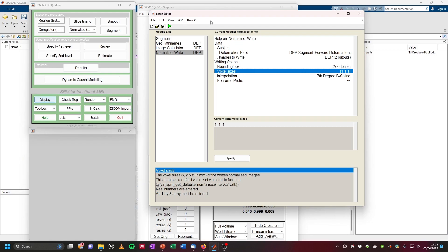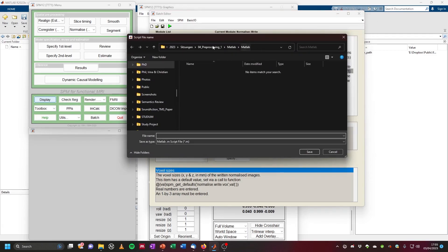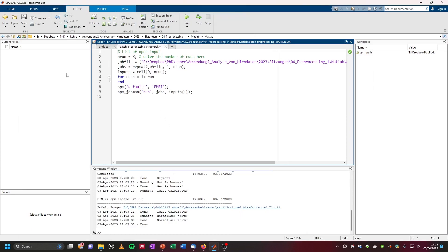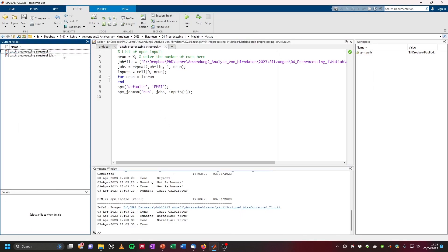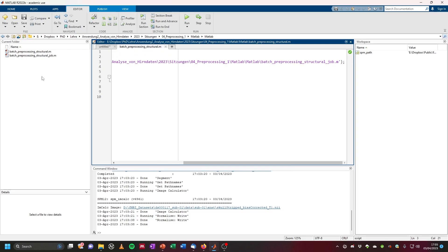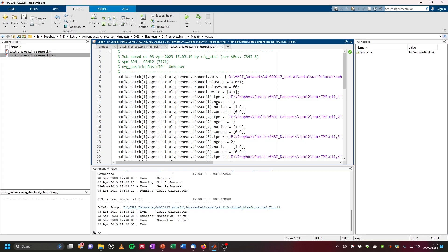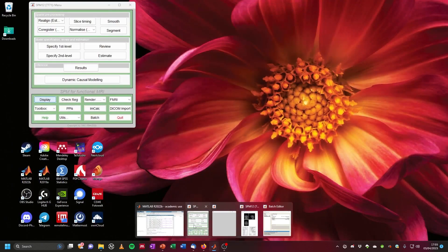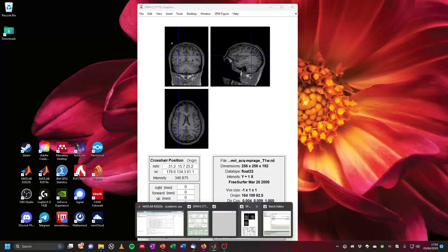We're done. I recommend saving your batches so you can use them later and also for your scripts. Click on file, then save batch and script, navigate to a reasonable folder, and save with a name like batch_preprocessing_structural. Two files are created: a script that calls a MATLAB job, and the job file itself, which is most useful for reuse in your SPM batch.